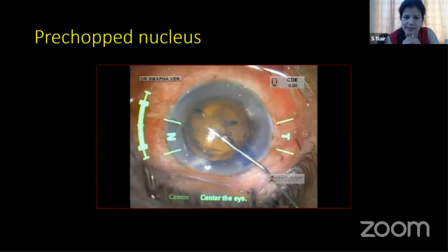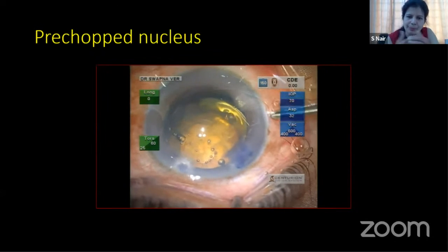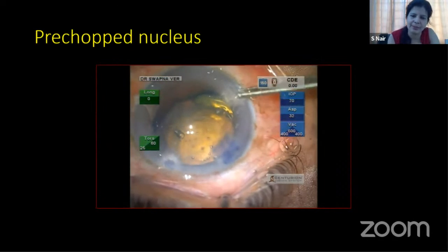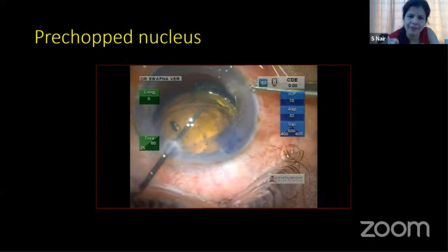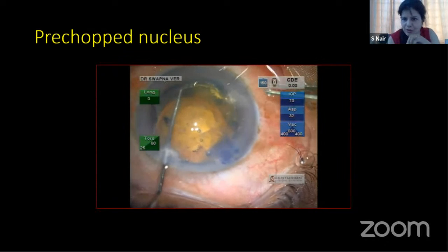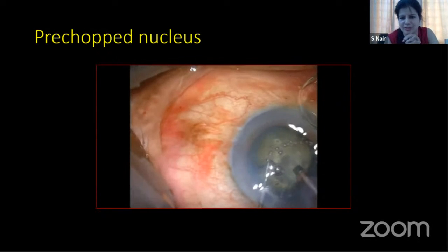Now, this is the patient on the table. You can see how the free-floating rhexis comes out, and all you need to do is a good hydro so that you can pass your CTR in. So this is not a way out of a CTR or a segment. It's only that some parts of the surgery are made much easier, but the application of a CTR or a CTS is inevitable in most cases of subluxations. There are few subluxations where you can just do a phaco under low parameters and get away with it, and the lens remains as such without tragedy.